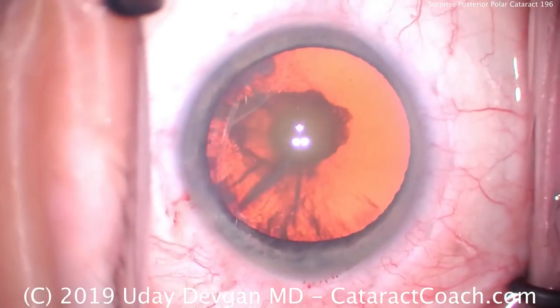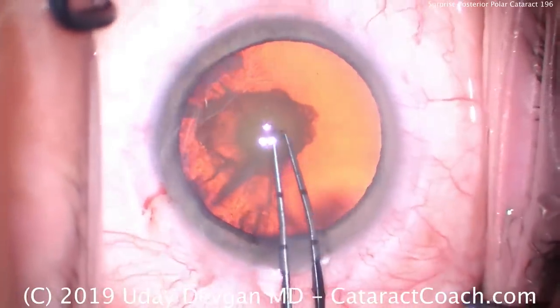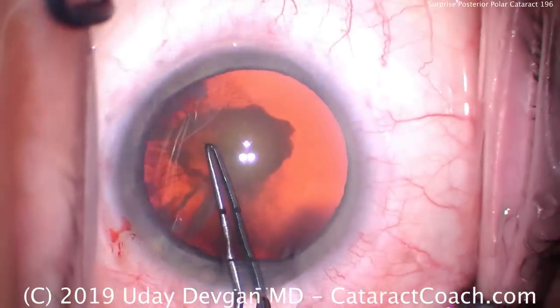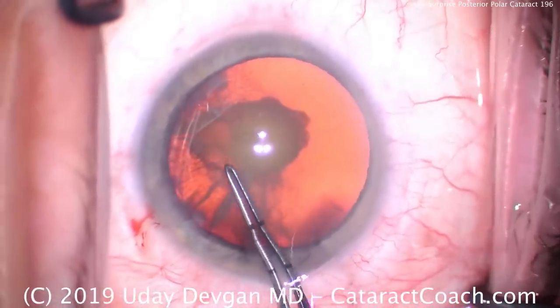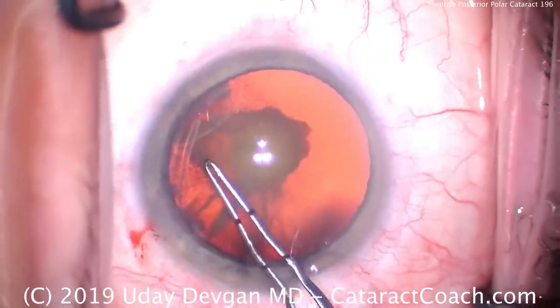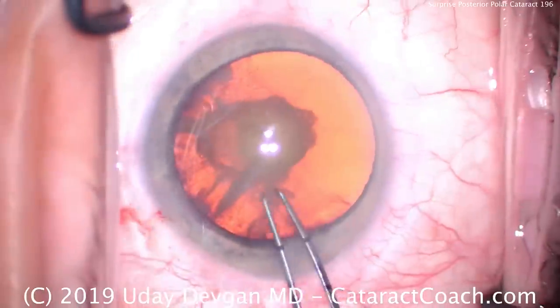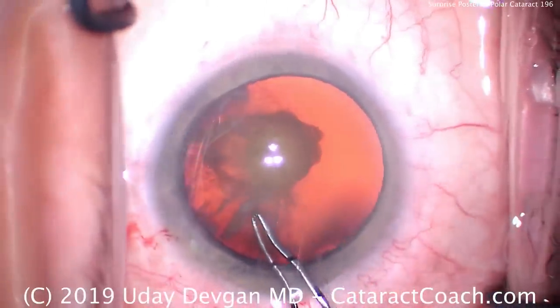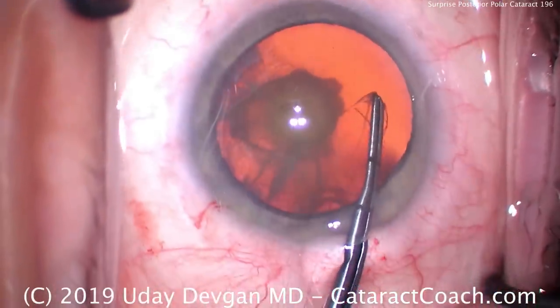What's the catch with a posterior polar? Well, the catch is that in a lot of these patients, the posterior capsule is weak, fragile, or even frankly absent. In the largest studies published by Bobby Osher and Abhay Vasavada, about one in three patients who have a posterior polar cataract can have an issue with posterior capsule rupture during cataract surgery. That's high — one in three.